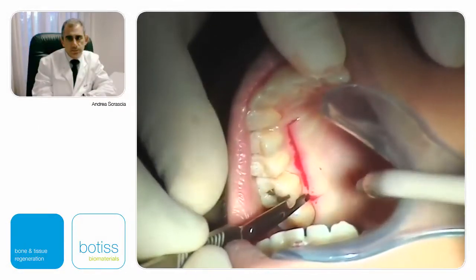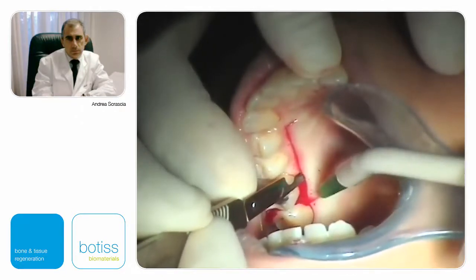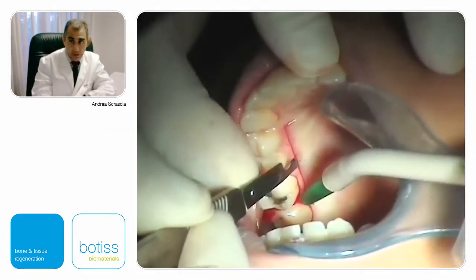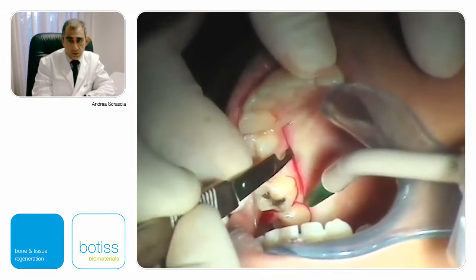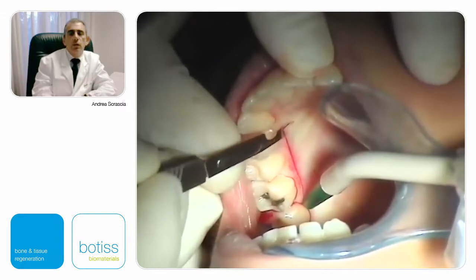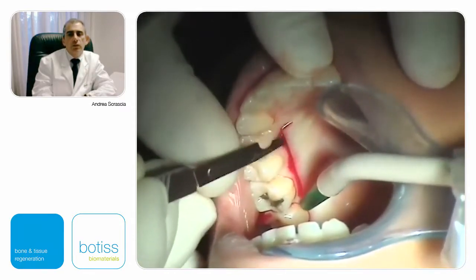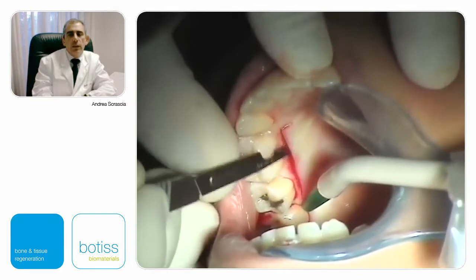So at this point, I insert the blade horizontally to separate the subepithelial layer from the connective tissue underneath.